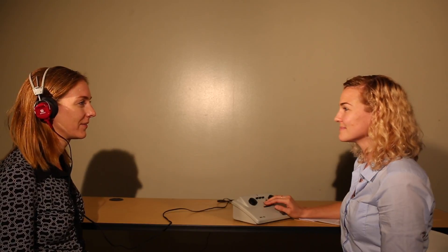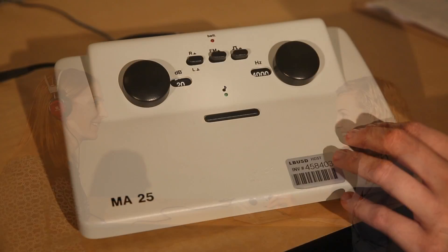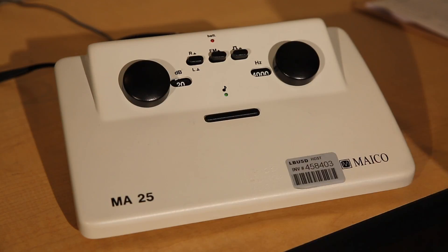A visual cue could be looking at the patient expectantly after you've pushed the button. An auditory cue could be asking the patient, 'Did you hear that?' A patterning cue could be asking 'Ready?' before presenting each tone. Don't present the tone too short or too long — either one of these can result in a false outcome. Present the tone for a medium amount of time.